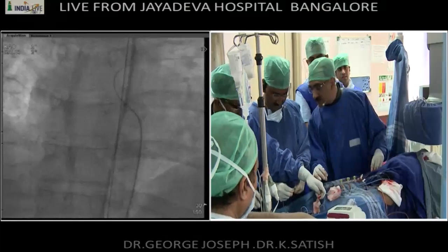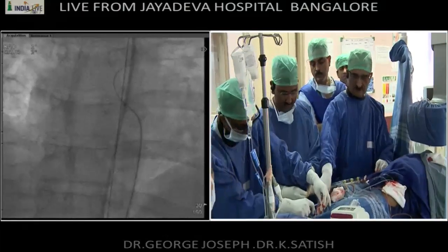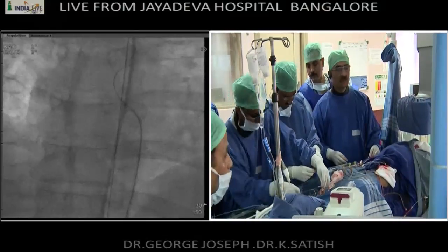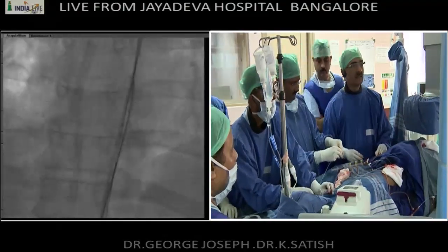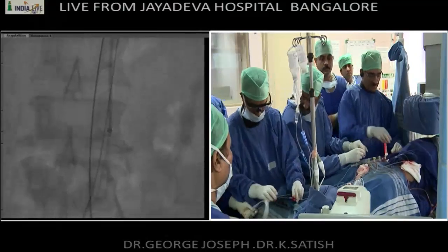Can you not work only on Terumo wires rather than exchanging for the stiff wires?